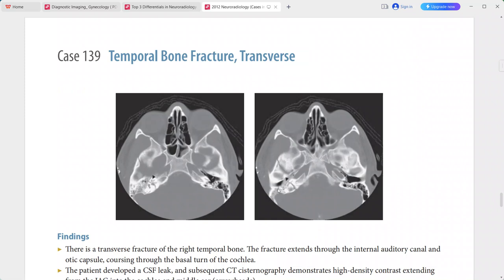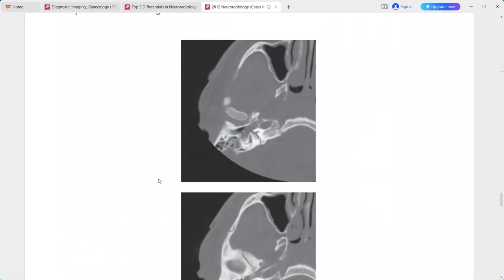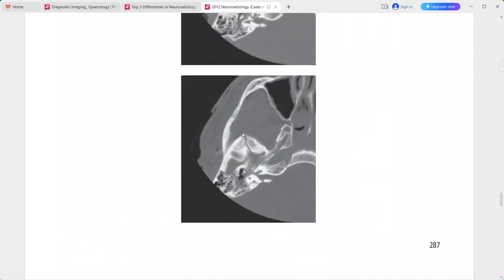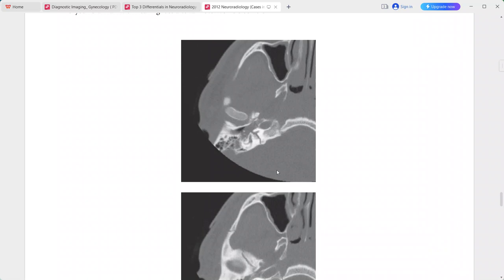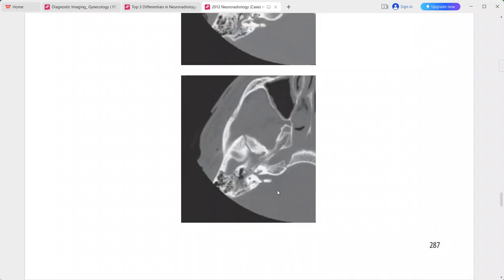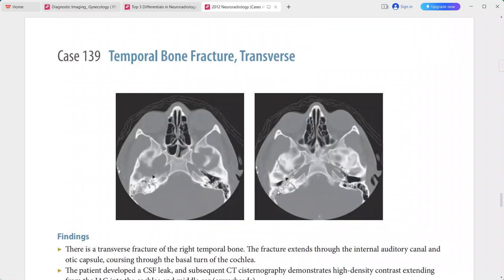The contrast is extending into the internal auditory canal and middle ear. This is a case of transverse fracture of the temporal bone. Longitudinal temporal bone fracture can be included in the differential.